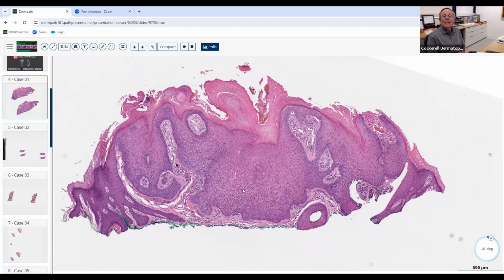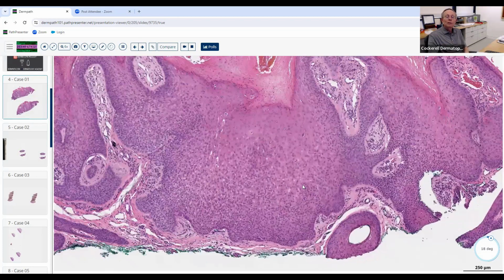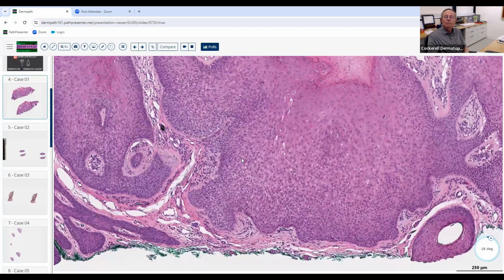There are really three main parts of the hair follicle, and then when you start thinking about it, there are some sub-elements of the follicle too that things can differentiate toward. So if this is follicular, which I agree it is, which part of the hair follicle do you think this is recapitulating here?